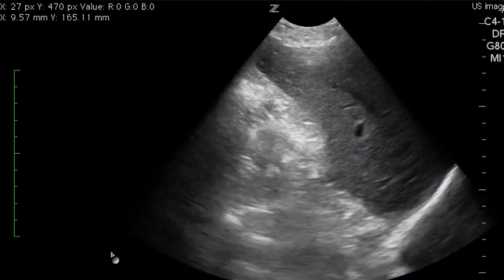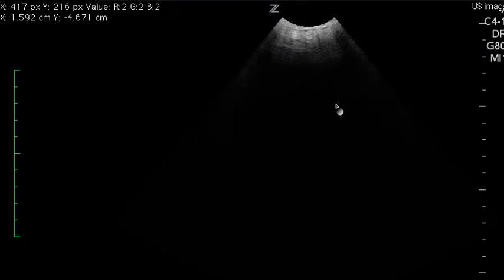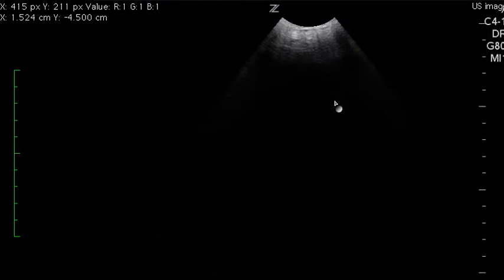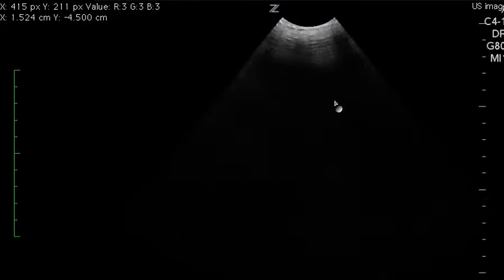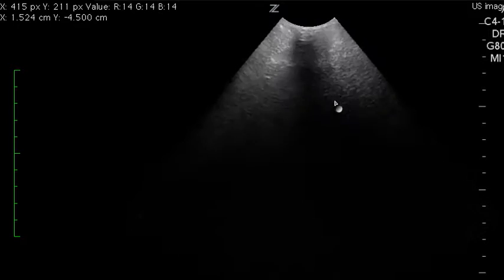Another thing I've noticed is that suddenly the probe just disappears like this. You have an image here, and then all of a sudden it leaves. And so when you record your images, make sure you have your organ of interest, your area of interest, press the save button on the Zonare, and then move it anterior and posterior. You have 6 seconds to do that.